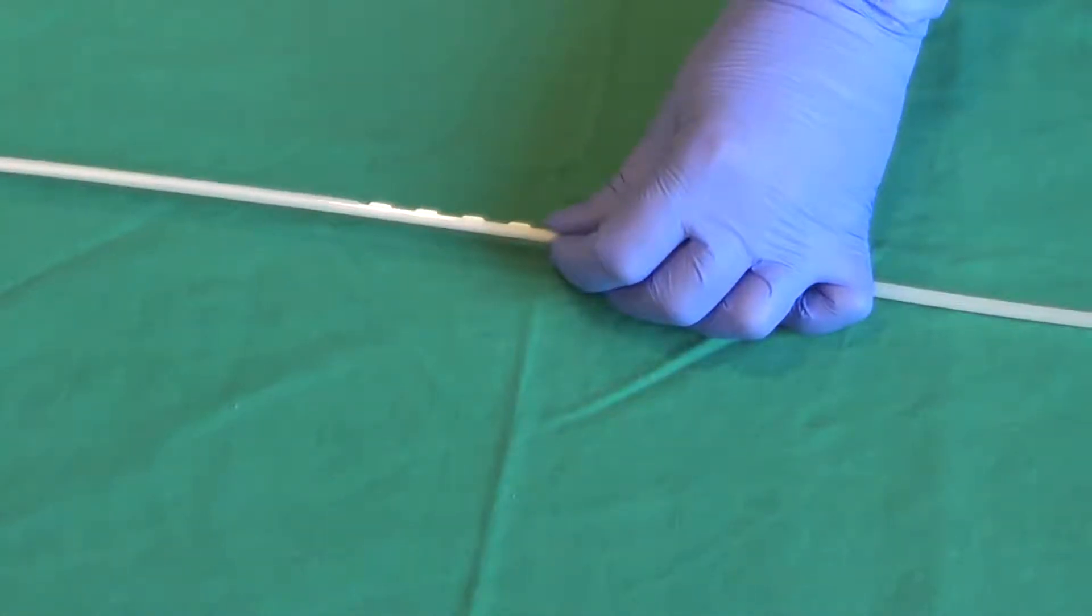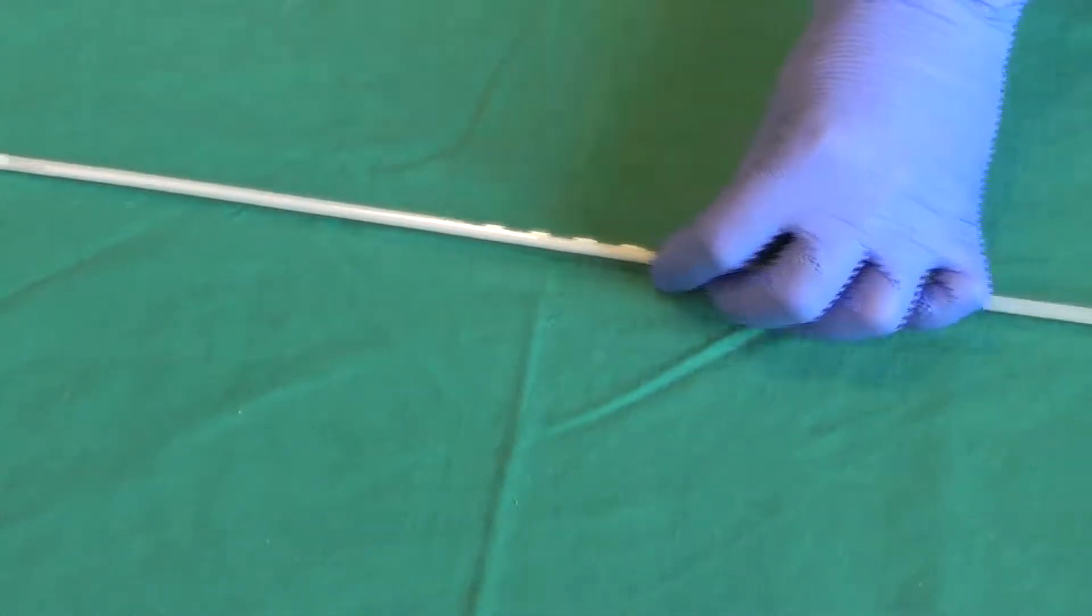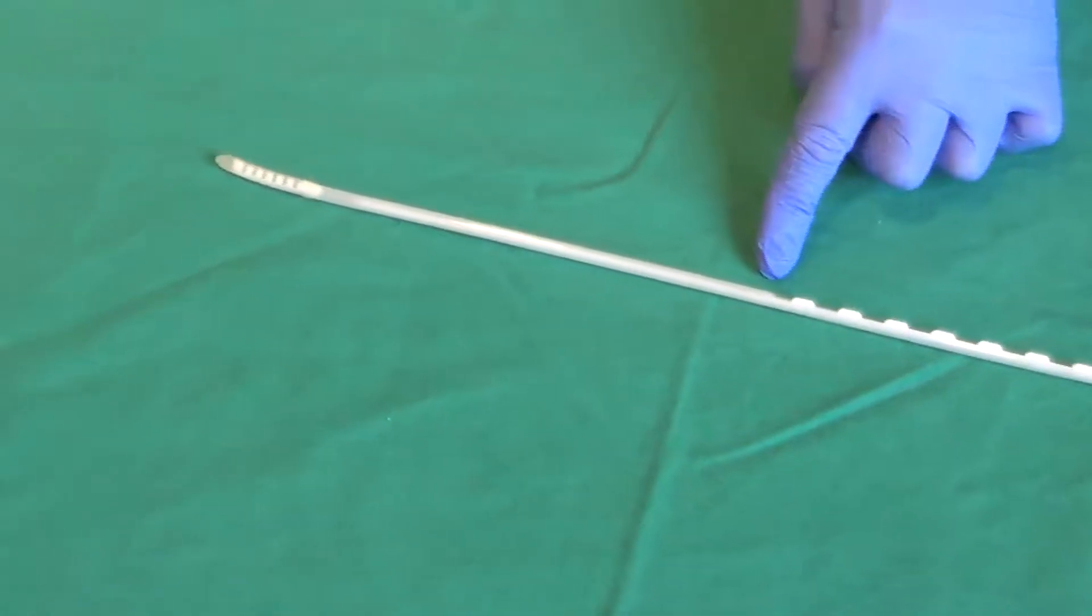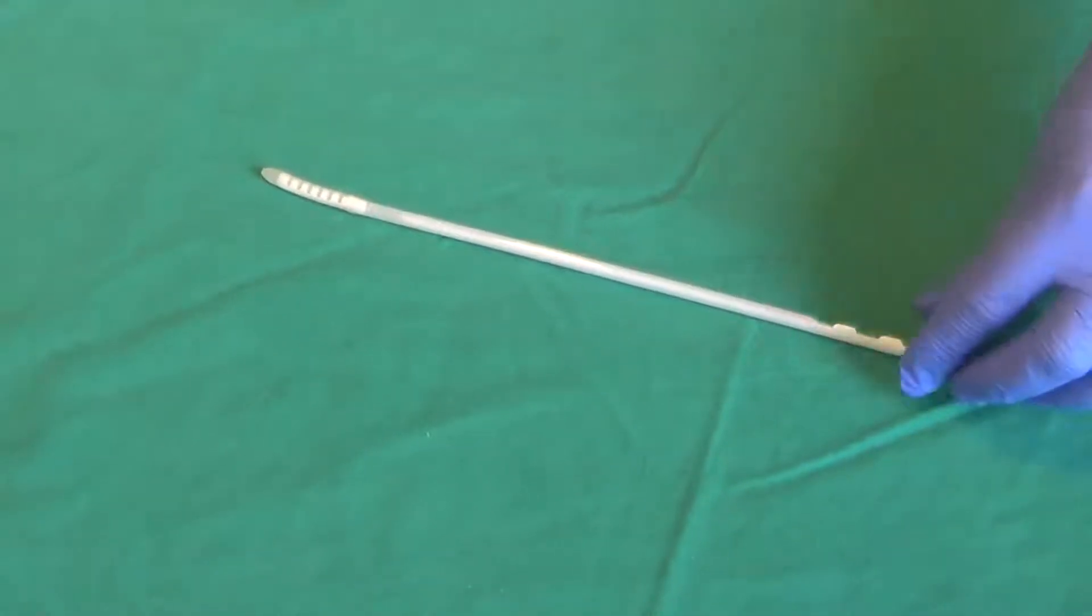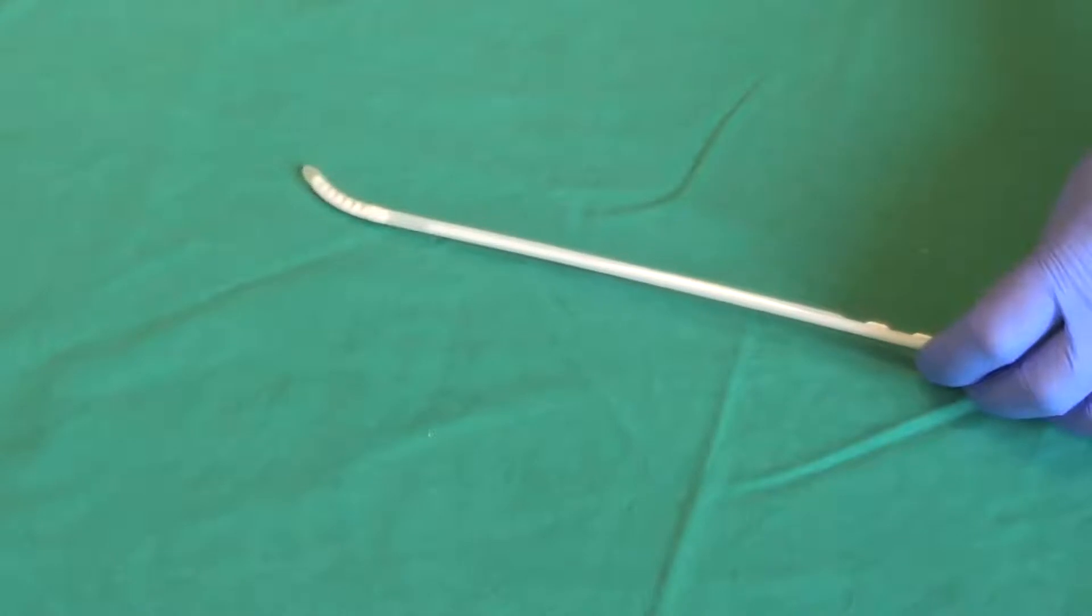It is positioned on the bougie so that it will not need to pass through the vocal cords. The blunt silicon tip minimizes the risk of tracheal trauma.